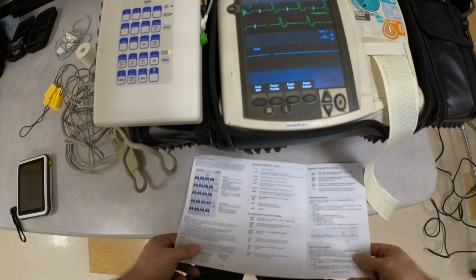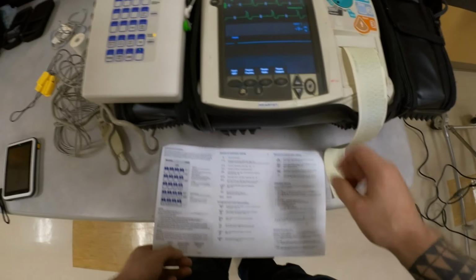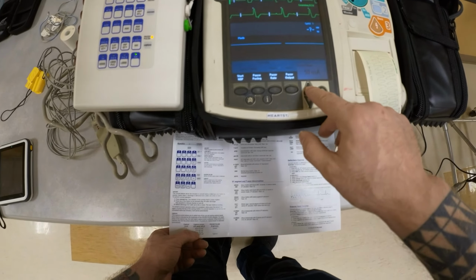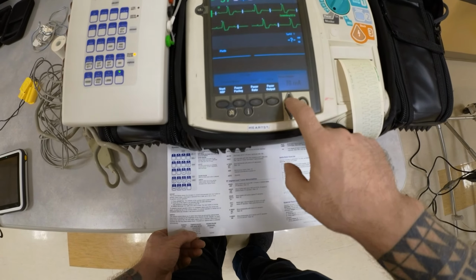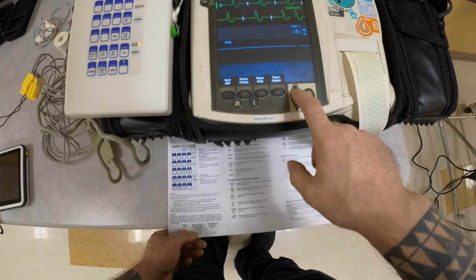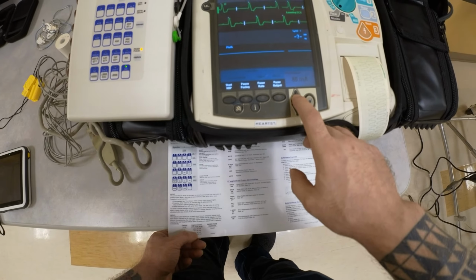I'm going to increase my milliamps. And if we are in level 2, we should get it between 75 and 80. So let me go to 75. All right, 70, I still see no capture. 75, I still see no capture. 80.